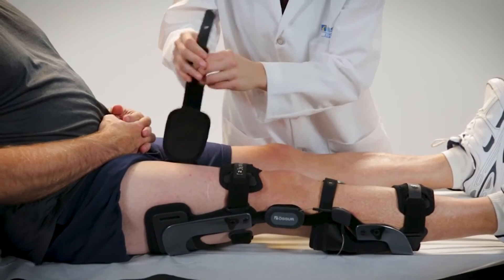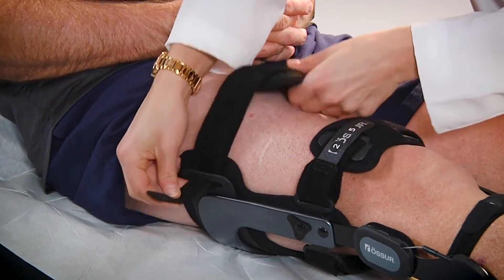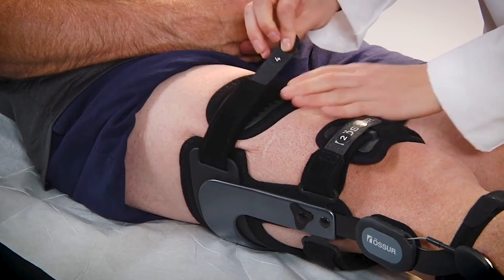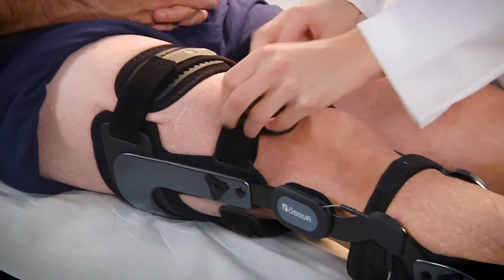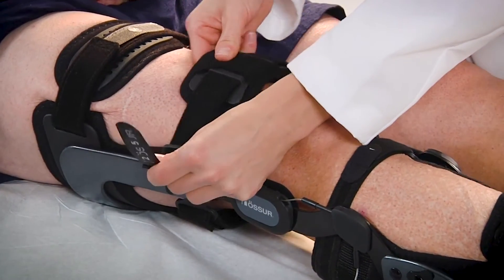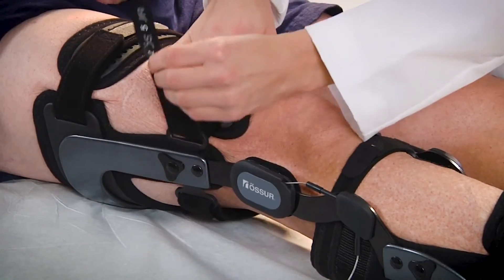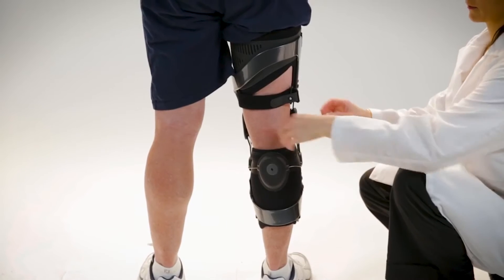Fasten the upper thigh strap by inserting it through the slot in the thigh subshell. Center and affix the hinges at the midline of the leg by fastening the lower thigh strap and centering the lower thigh pad, and then fastening the rear thigh strap.